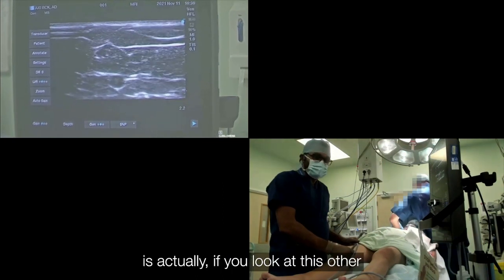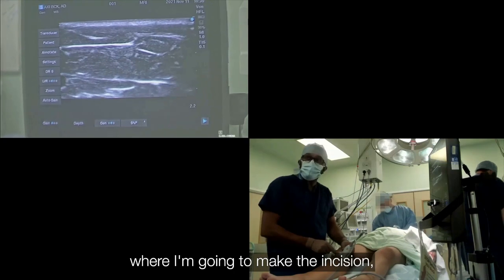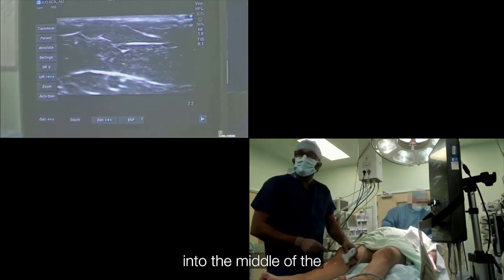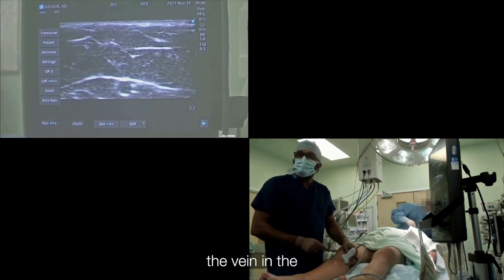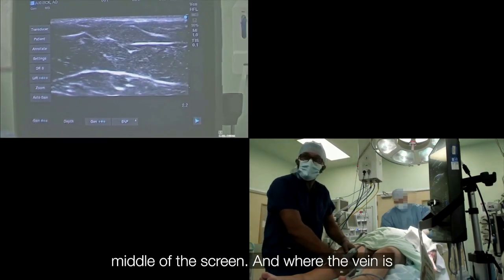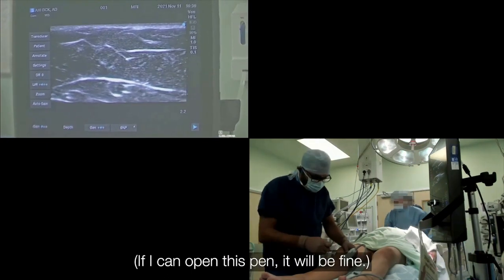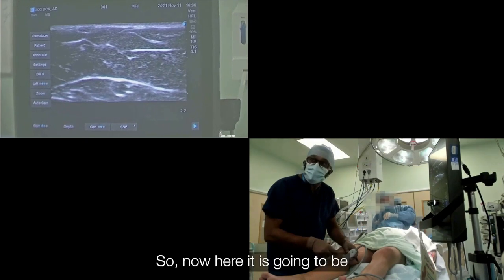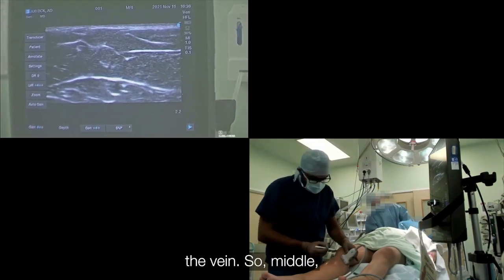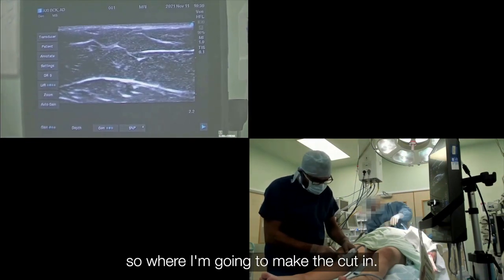The benefit of this vein mapping is that if you look at the other picture, you can see I am at the knee area where I am going to make the incision. So I move the probe into the middle of the screen — where the vein is, the middle of the probe is going to be where the vein is. Here it is going to be the vein, and I am exactly marking where that is, where I am going to make the cut.